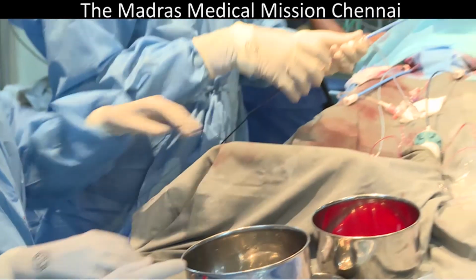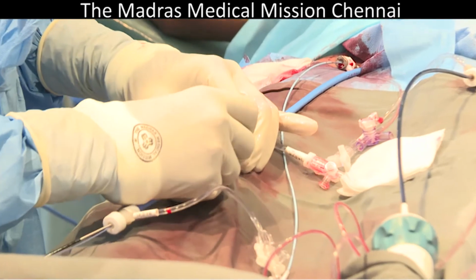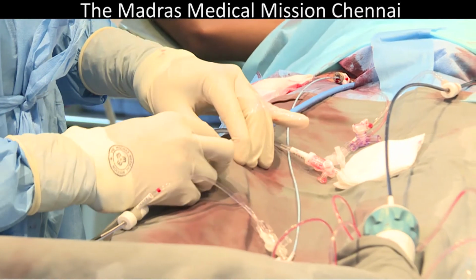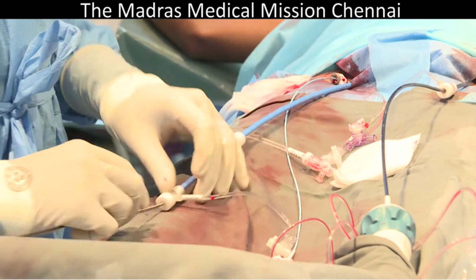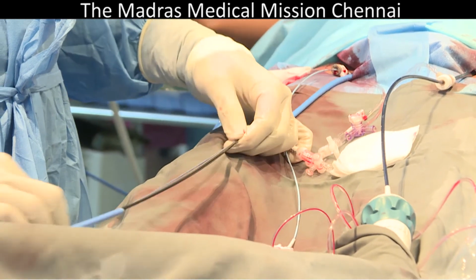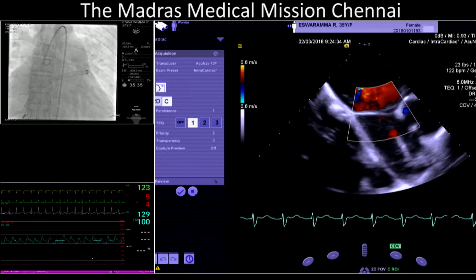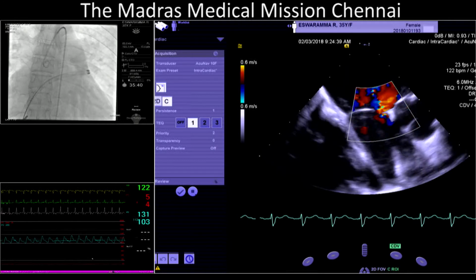So now the whole assembly is loaded on to the... So the wire that you have placed through the fenestration is just if you have to go and balloon this once you have deployed the device, correct? Actually, in fact, even otherwise I will balloon it. The reason is to make things coaxial.